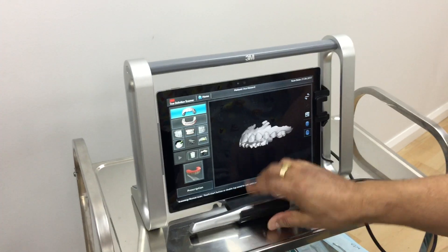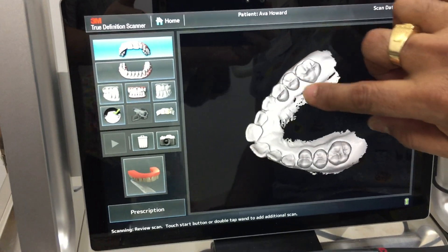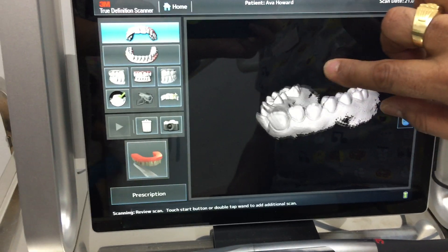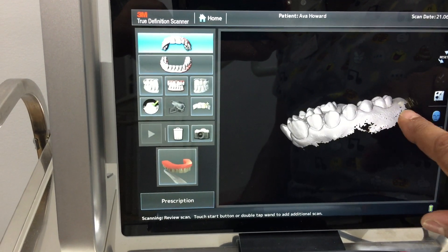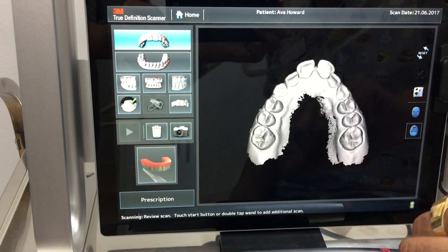Here's a scan that we've just done. This is a 3D scan, so once we've done the scan we can twist it around and have a look at it. These black holes are just areas that we didn't scan — we've got what we need. That's the upper jaw.